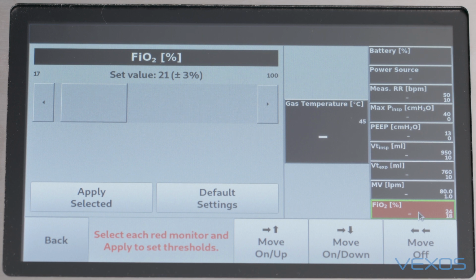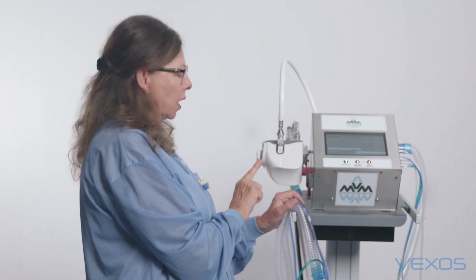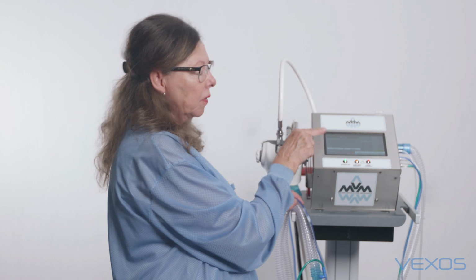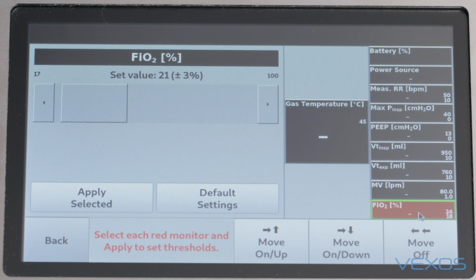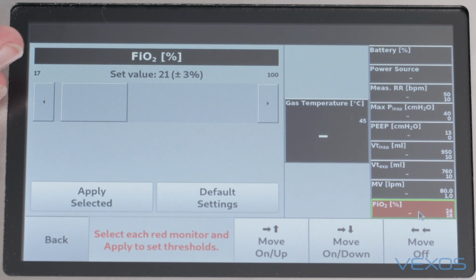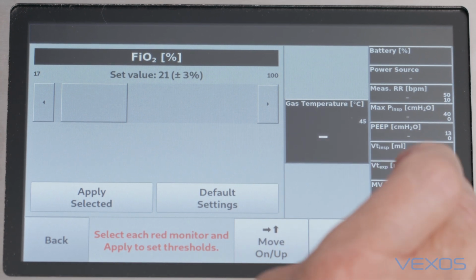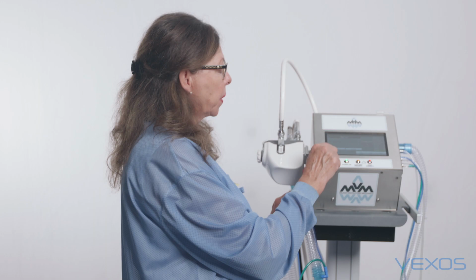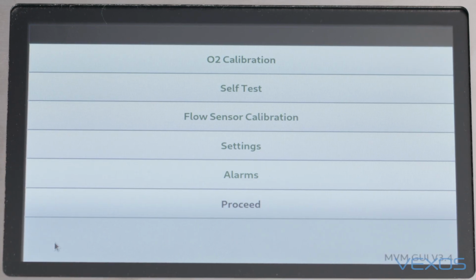The oxygen is not an alarm per se. In here, this needs to be set to exactly what the blender is set to. So if I have 21 on the blender, I need to set 21 here. If I have 30 on the blender, I need to set 30 here. The machine will actually automatically set 3% higher and 3% lower as the alarm. So I've done this, I've applied, and I'm now ready. At the bottom it says all alarm thresholds confirmed in green, and I'm ready to take me back to the startup page. Everything is in green, so I've completed everything.